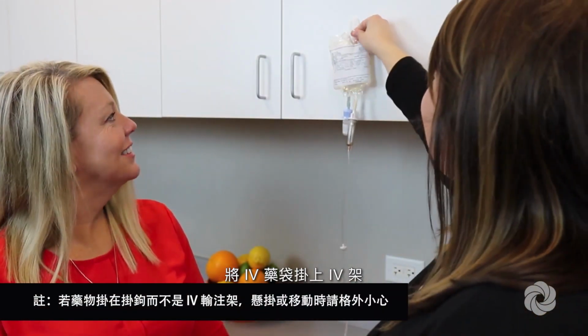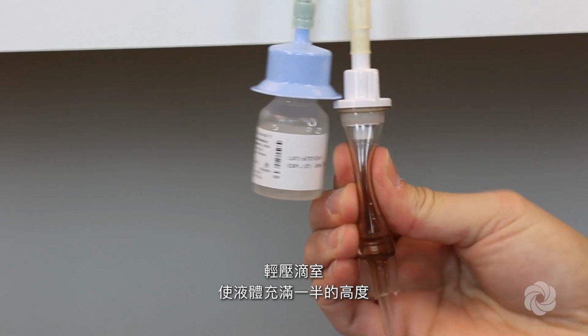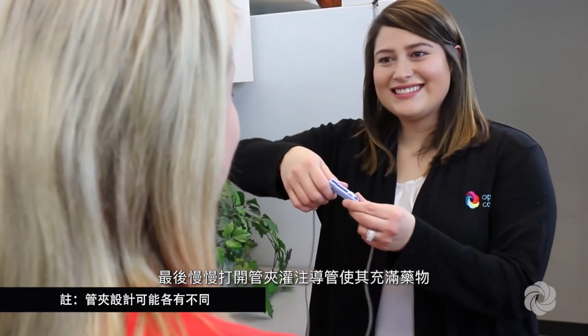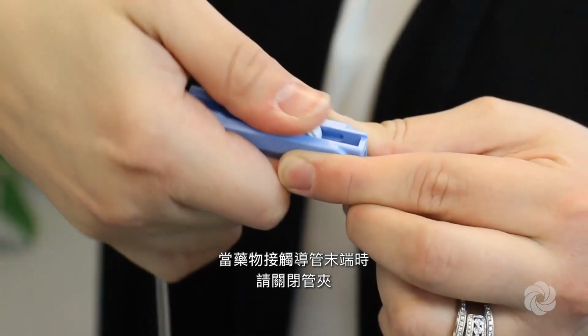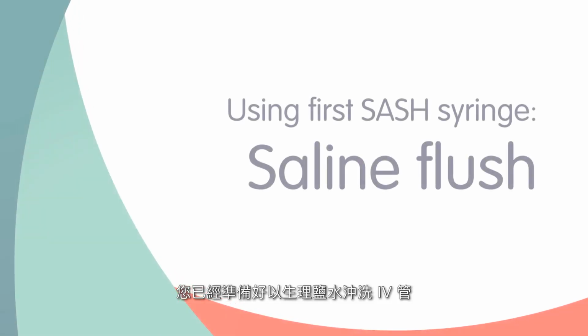Hang the IV medication container on the IV pole. Gently squeeze the drip chamber to fill it about half full of fluid. Do not overfill. Lastly, slowly open the clamp to prime the tubing, filling it with medication. When the medication reaches the end of the tubing, close the clamp. You are now ready to flush your IV line with saline.